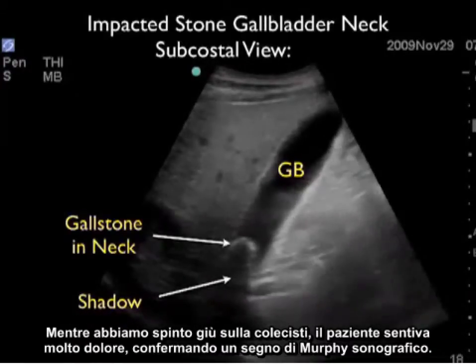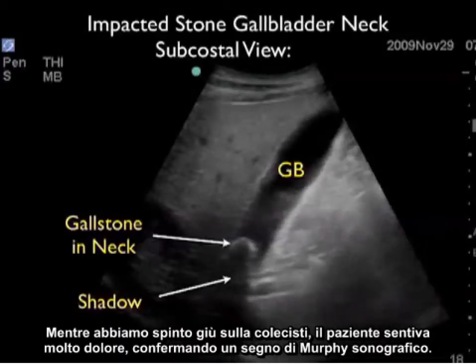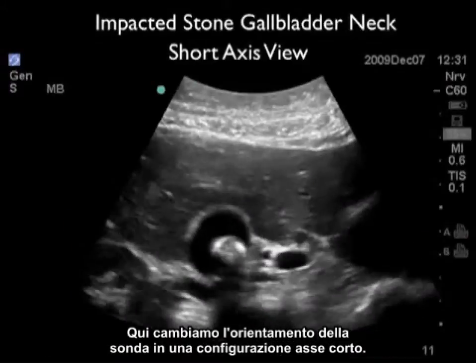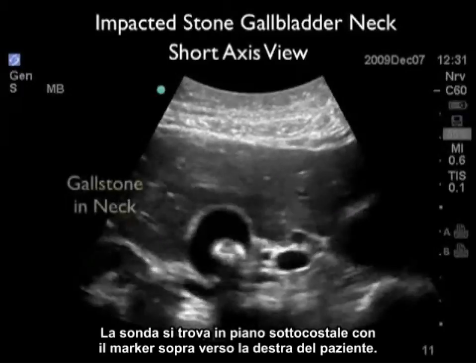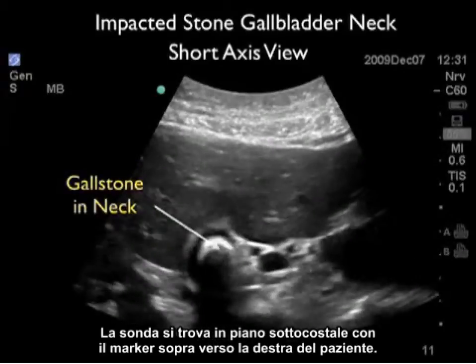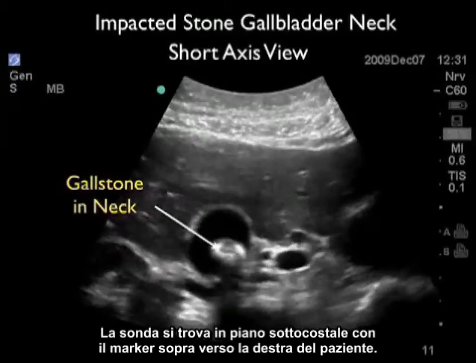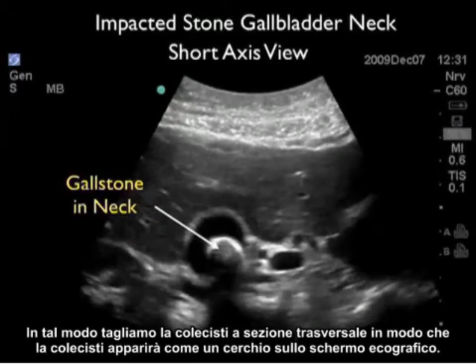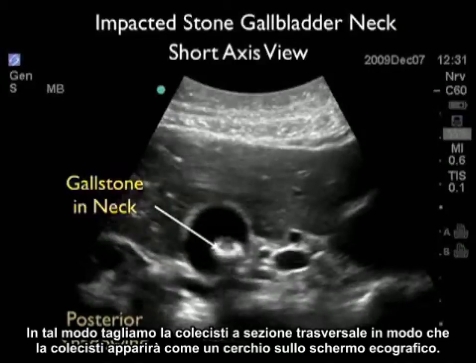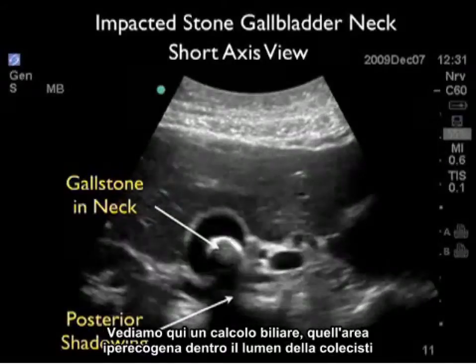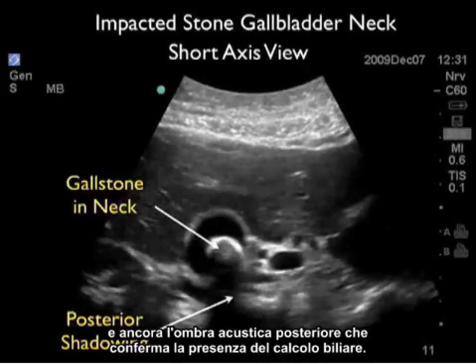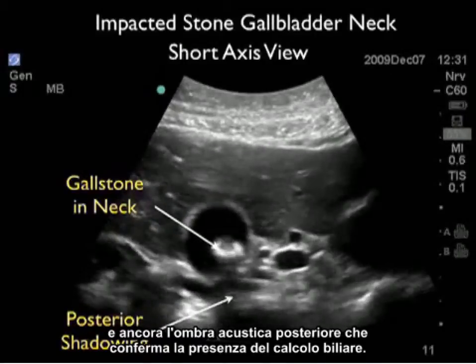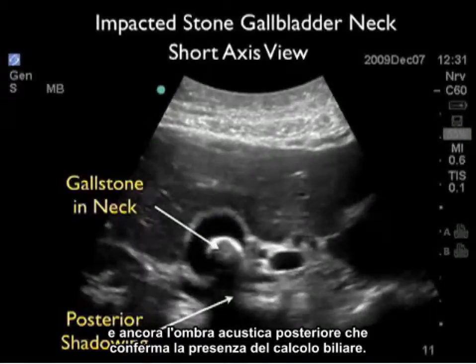As we pressed down on the gallbladder, the patient had significant pain, confirming a sonographic Murphy's sign. We then changed the probe orientation into a short axis configuration from the subcostal plane, cutting the gallbladder into cross sections so it appears as a circle on the ultrasound screen. We again see the hyperechoic gallstone within the gallbladder lumen with posterior acoustic shadowing confirming its presence.